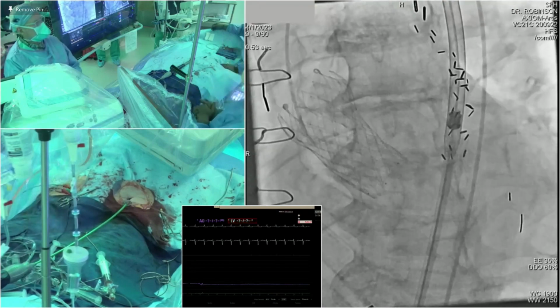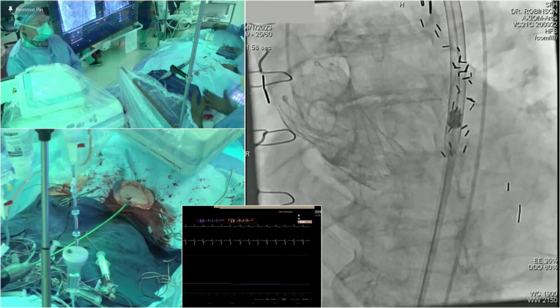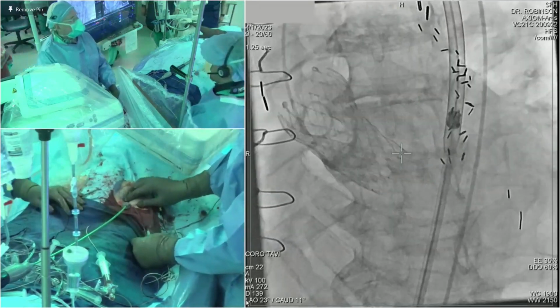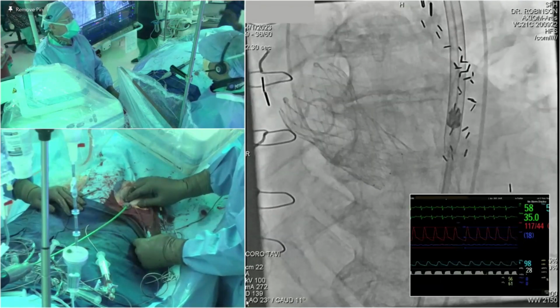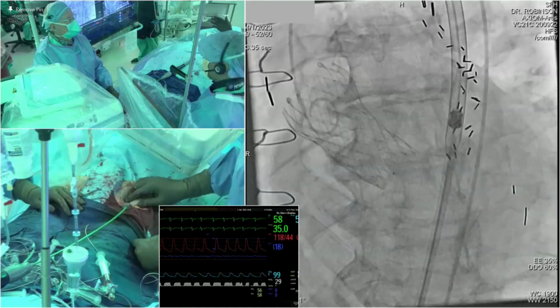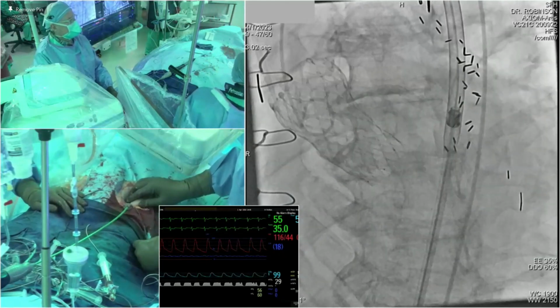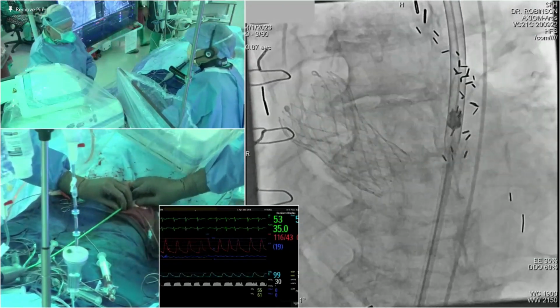So there's probably 2+ aortic insufficiency. So the ventricle is filling. My vote would be just take a 20 balloon and just make it a little better and call it a day. Is that okay? And you can see actually, on the left-hand side, we're still in LAO, so the left cusp is isolated on the left. You see that big chunk of calcium that you saw on CT. That's where the PVL is as well. And so that's what we're trying to address. Looks nastier here than it did even on CT. Yeah, it's pretty bad. So we may not be able to beat that, but we'll bump it out a little bit. All right.